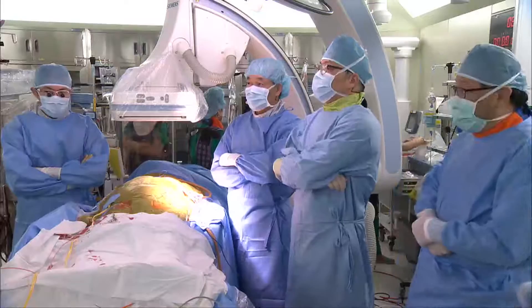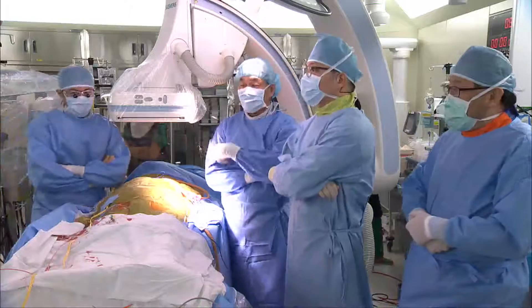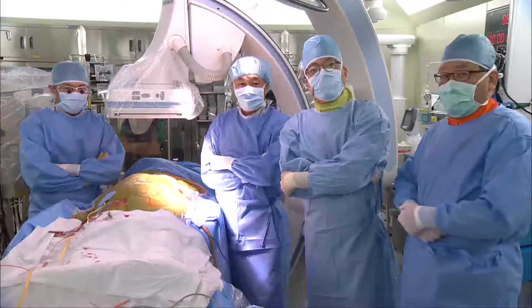So we're going to introduce our patient. We are ready to go and I think we'll ask Dr. Gang to present the case summary. I'm Dr. Gang of Aslan Medical Center and I will introduce our patient.